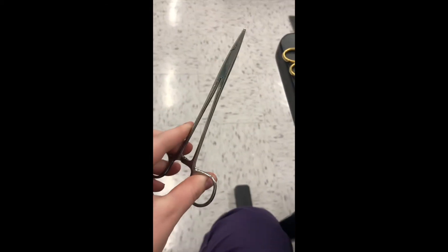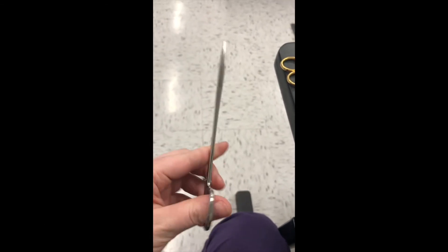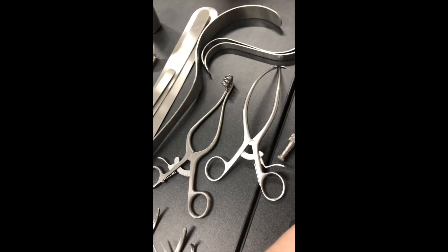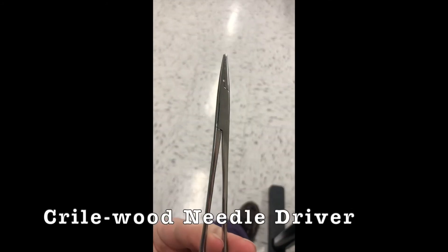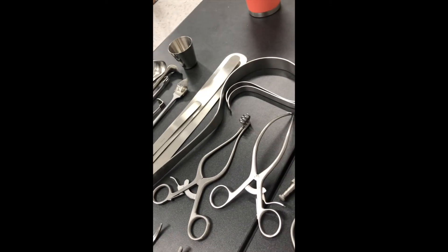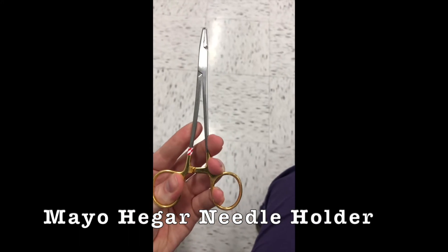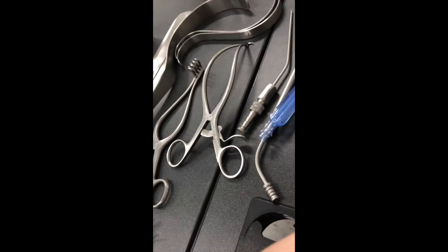Okay, here is the suture holder — needle driver, thank you. Needle driver. And then there's the Mayo — Mayo-Hegar — and then the Crile-Wood.